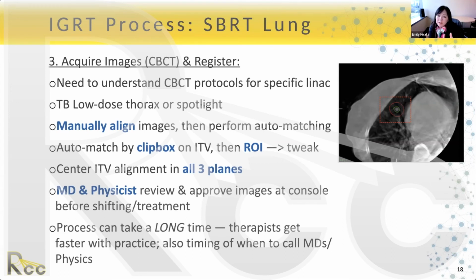The physicist understands the technical aspects. We know how the plan was delivered. We know the arcs that are being used. We know how all of that is going to be affected based on IGRT. Really important to have the physician and the physicist review those images, give the therapist the okay, yes, this looks good, shift the patient, and proceed.